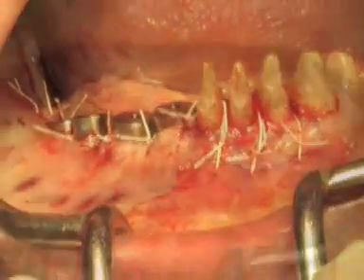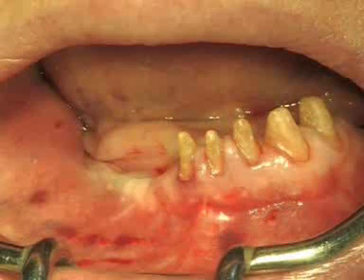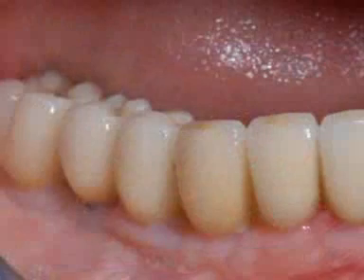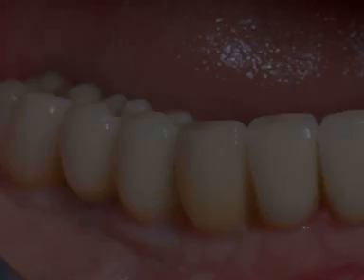The initial situation, where there is a big difference in level between the implants and the natural teeth, can be compared with the prosthesis, which thanks to this surgery is more or less at the same level as the natural teeth.